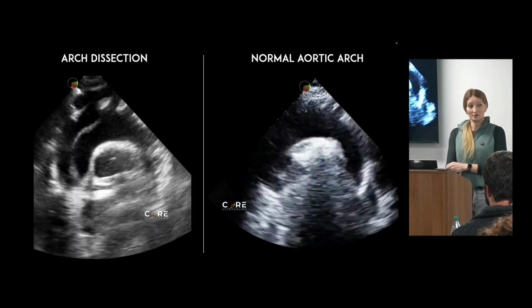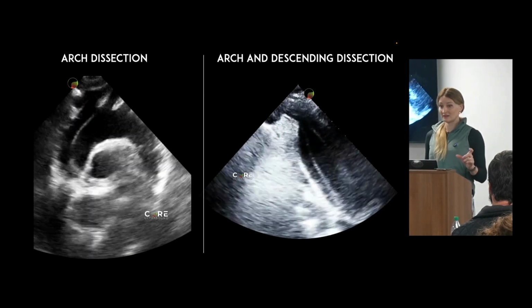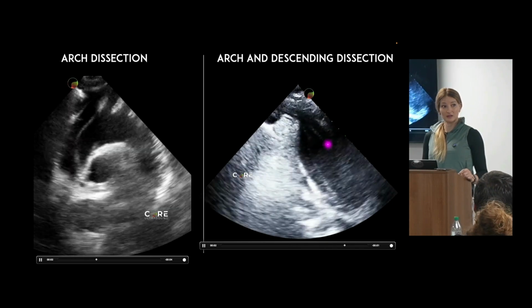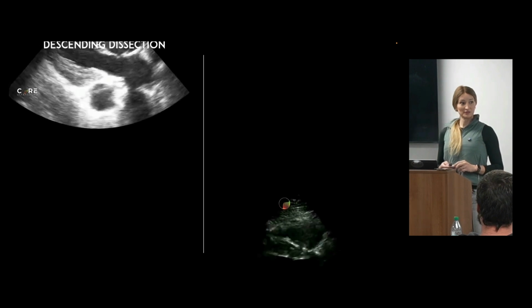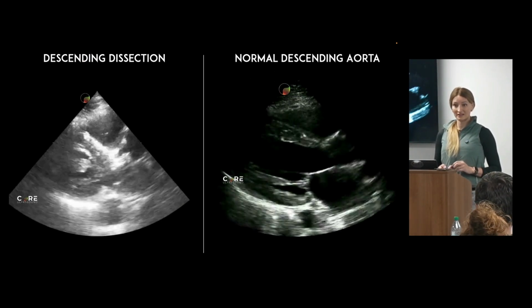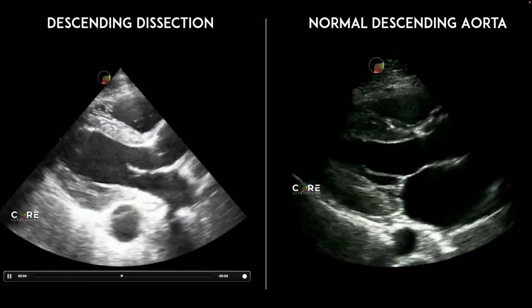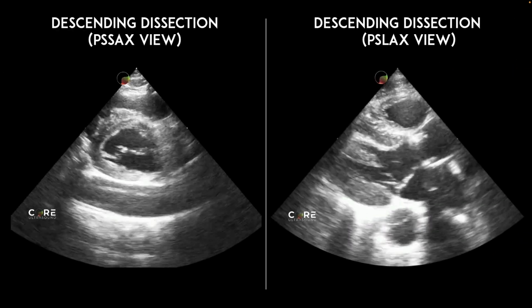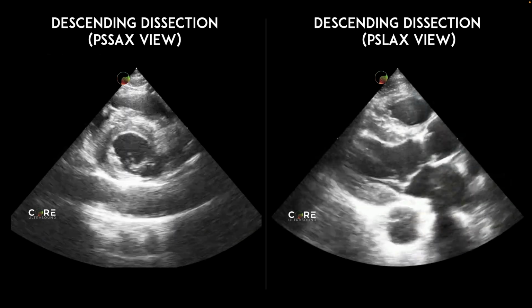Good with that? Yeah. This is a different patient who had a quite dilated descending aorta, and you can see it's almost like two guitar strings over here. This one did extend all the way to the root as well. This one's a little more easy to see. You see it on that left side, on the descending aorta, on that cross section? Right there. You shouldn't see anything in the aorta. If you see anything in the aorta, it's abnormal. And with that same patient, we can turn it into the long axis and you can see it wiggling there. We good with that?